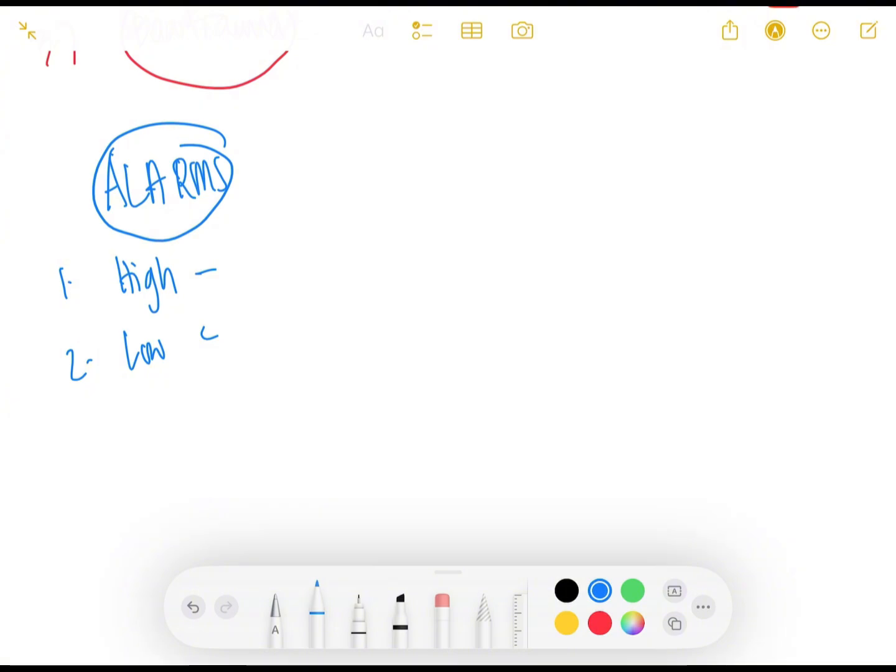So, this is when there is increased resistance. Increased resistance, 'di ba? Lagi nating example when it comes to pressure, okay? Kapag mas makipot yung daanan, mas mataas ang pressure. Okay? So, ang tandaan lang ninyo, kapag high pressure alarm ang tumunog, possible na merong increased resistance, merong bumabara or umiipit sa tubo. Okay? Kasi ang tandaan, pag mas makipot, okay, ang daanan or ang tubo, mas mataas ang pressure.